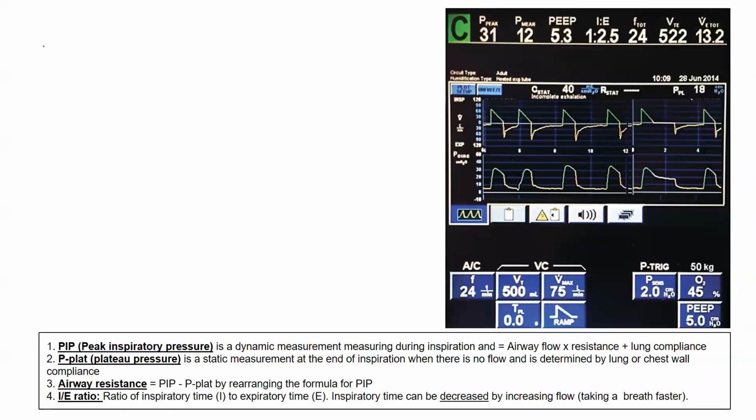Auto-PEEP? Yep. So this patient, AC, so then frequency, tidal volume, and then PEEP, and then FiO2. So kind of just looking at the vent.